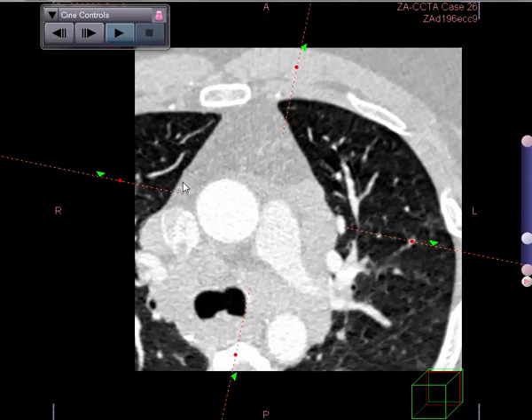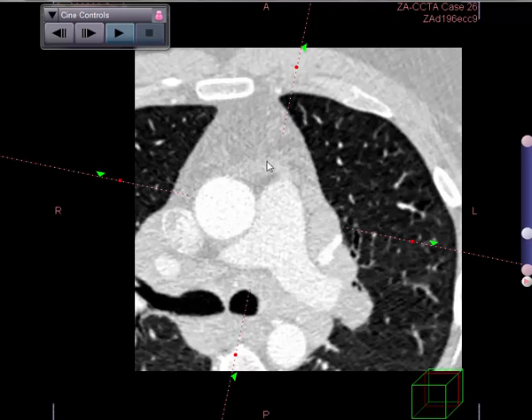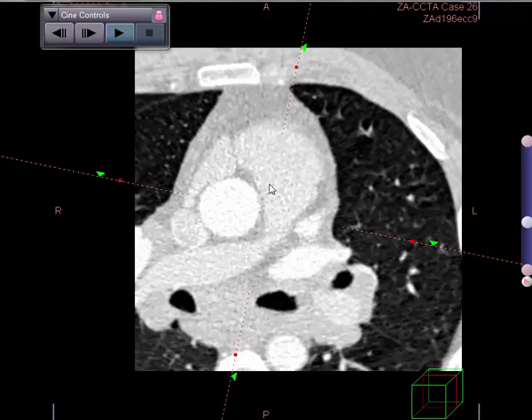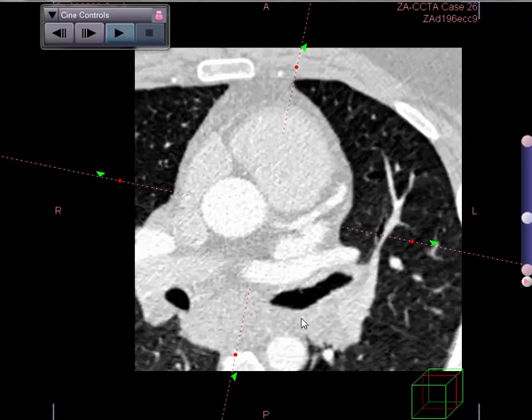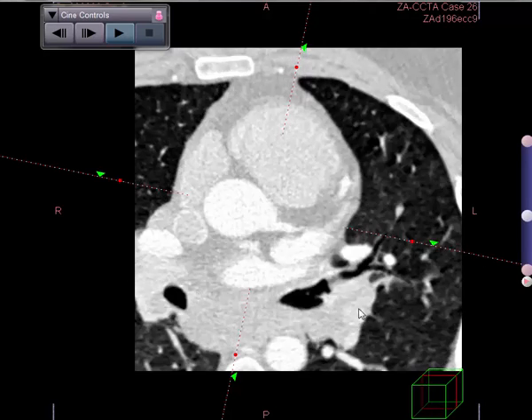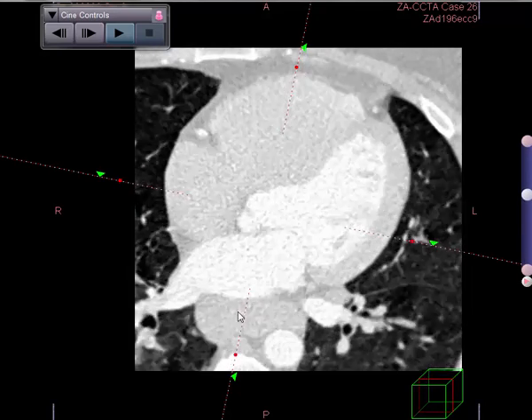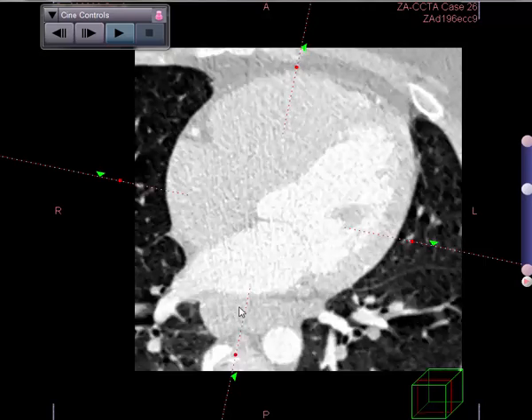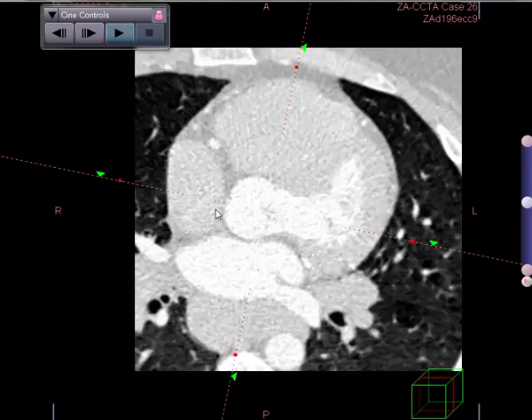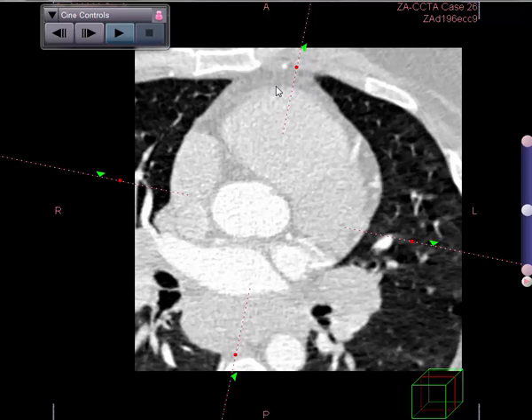As we look around the aorta, you get an idea that there's a fullness involving the anterior mediastinal surface. Proceeding caudally, you can see around the pulmonary trunk some encasement of what appears to be solid tissue. We can get a better idea of the density of this — could it be fat? Well, this is fat up here in the anterior mediastinum involving the heart.